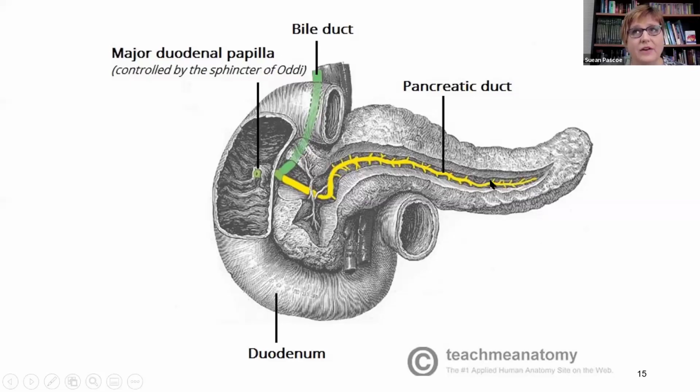Now, in the normal pancreas, you don't often see the pancreatic duct too much, and usually when I do, I'm starting to think is something else going on. And having said that, we've had a patient this week who just had the most beautiful looking pancreatic duct that I wish I'd got some pictures of. It's clearly part of normal pancreas, but if I do see it so clearly, I start to think about what might be going on. I guess with some of the great technology that we have, everything's becoming much more visible.